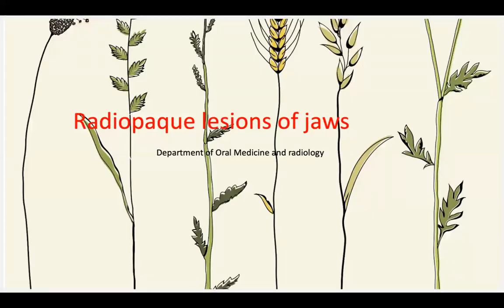Good morning, everyone. Today we will be discussing the radiopaque lesions of the jaw.